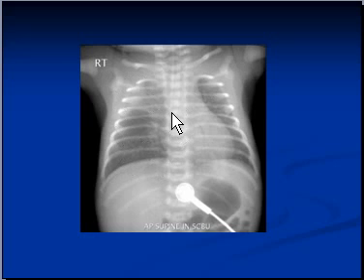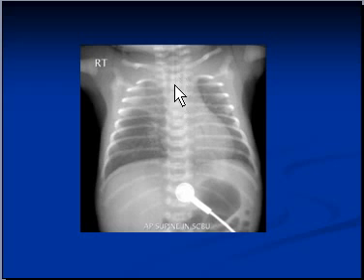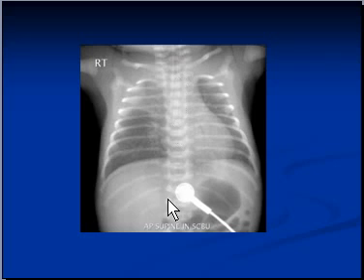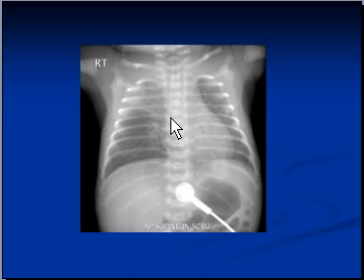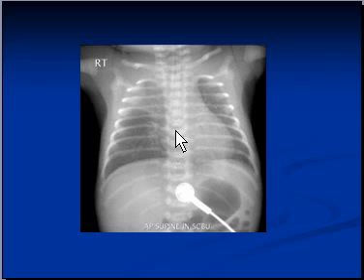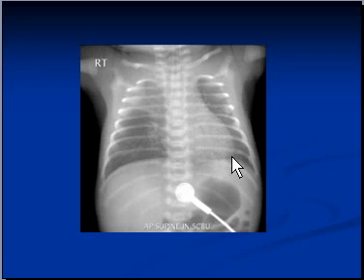Although the carina or bifurcation of the trachea is not visible in this x-ray, the tube is too far in for comfort. As we know from a previous video, if the endotracheal tube is below the level of the carina, it will end up in one of the main bronchi — either the right or left main bronchus — blocking oxygen supply to the other lung, causing it to collapse.